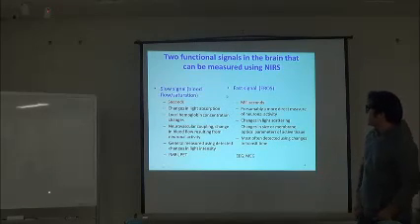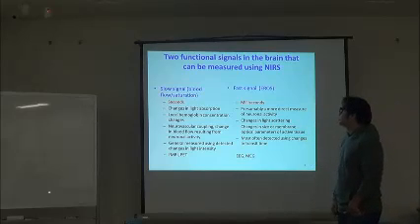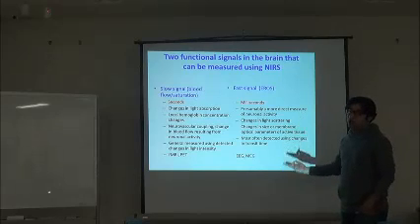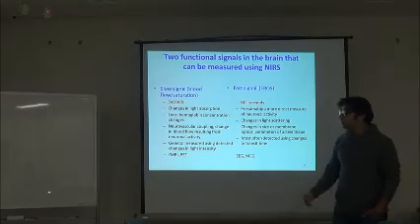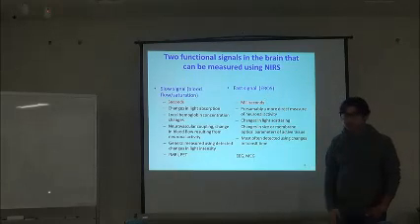Well, here it is, the thing that you asked about, the slow and the fast optical response. So fNIRS can actually potentially measure two kinds of responses in the human brain. One is called the slow signal, which I have explained before. We were talking about the slow signal so far. We have not touched the fast signal yet.